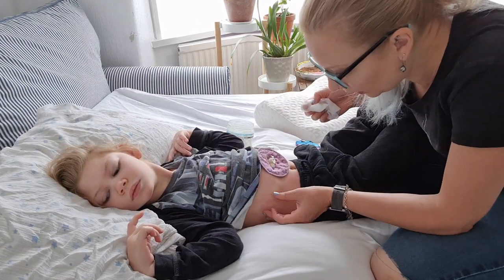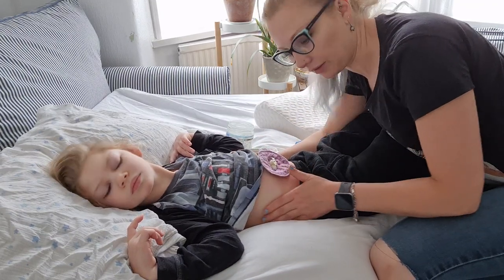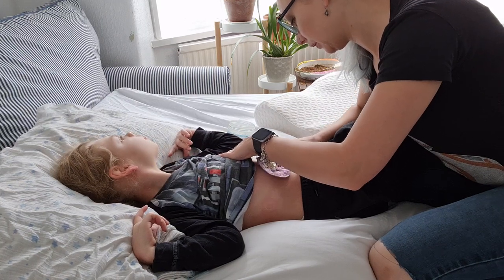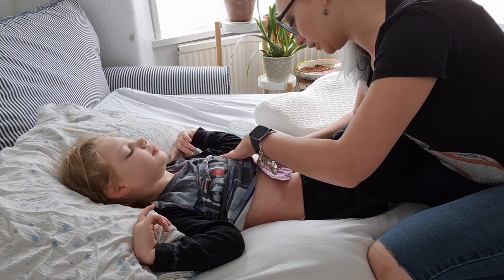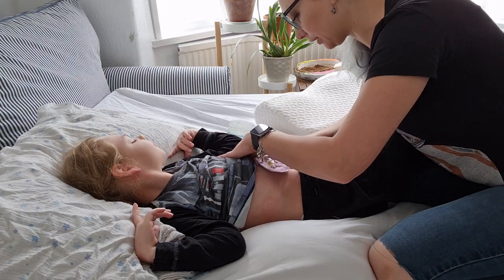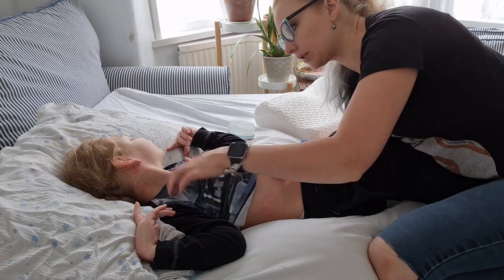Okay, and it's coming off. It's taking a little time, but this is a really good way of doing it that isn't very painful. And after having had those stickies on the skin for several days, moisturizing the skin a bit with the coconut oil is a good idea anyway. In general, oil is a really good one for when you need to remove anything sticky and gluey and plastery, because it does stay on the skin for a long time, this stuff, which isn't very nice. Right. That's how I do it. I am going to do the rest of her sticky residue up here in a moment.